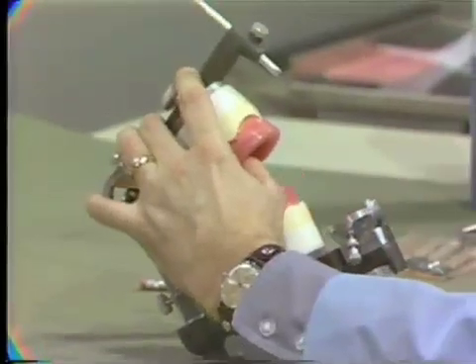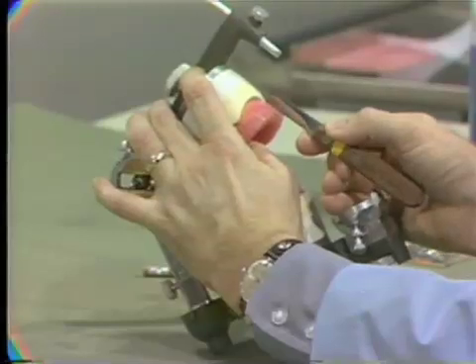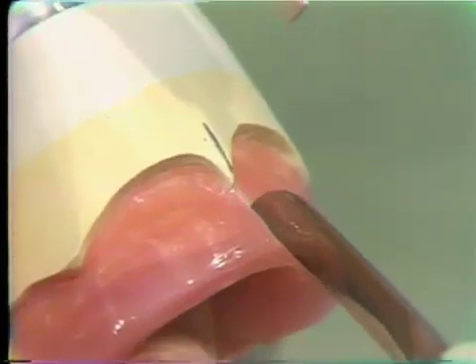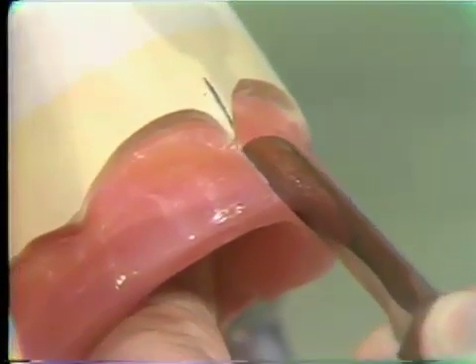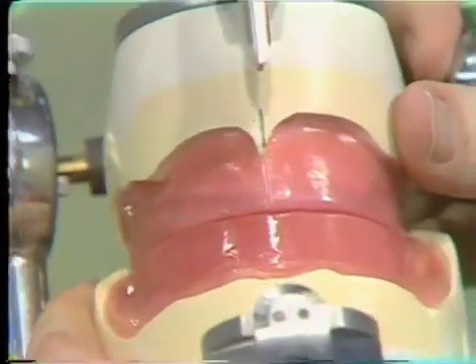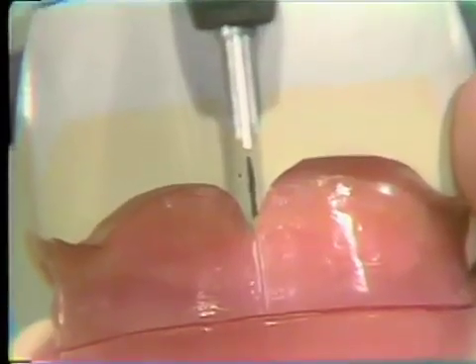open the articulator and actually scribe a line. I'll scribe it first using my eye and then let you see what I've done. I'll scribe it using a knife and then let you see what I've done. Okay. Now again, the wax is marked so that we are in the midline.